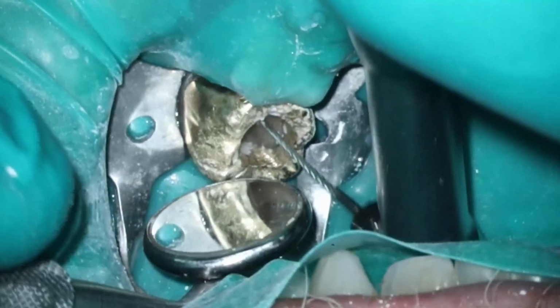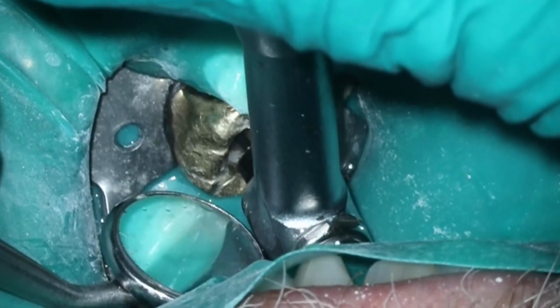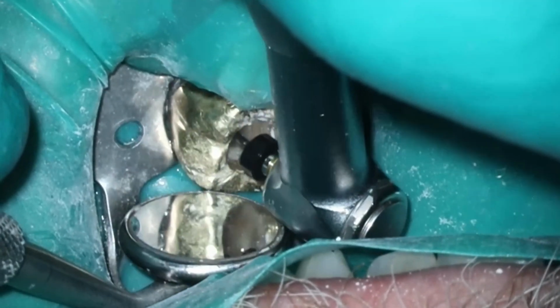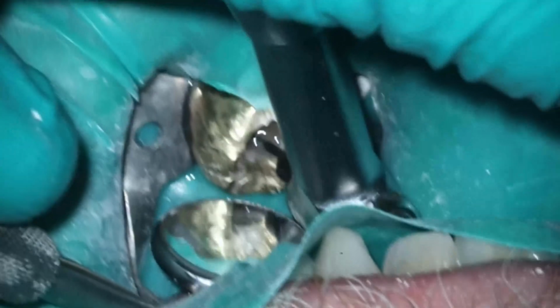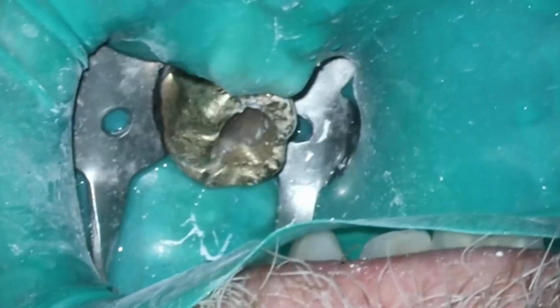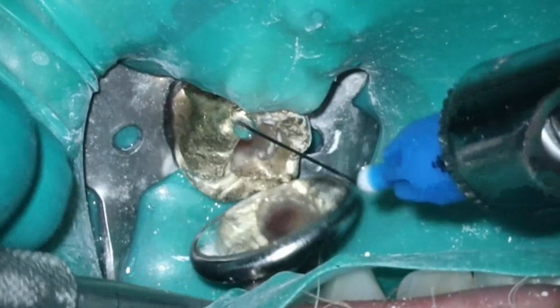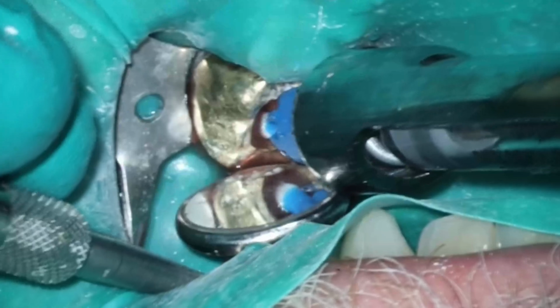That's one thing we don't like to really talk about, I think, in dentistry: we are humans. We are prone to causing errors. We make mistakes. All of us make mistakes. I make mistakes. The people who taught me make mistakes, and you will as well. It's just important to realize what type of mistakes you are most prone to making and try to avoid them as much as possible. The medical field is far, far, far ahead of us compared to dentistry. It's almost embarrassing how bad dentistry is with radiology and its interpretation.